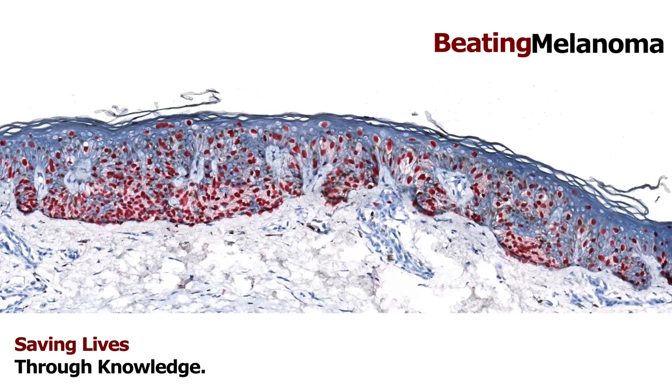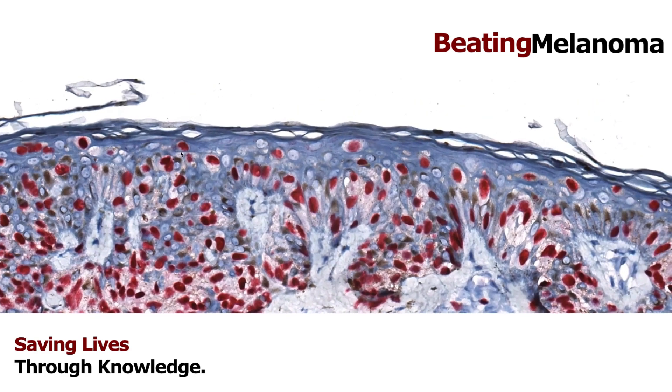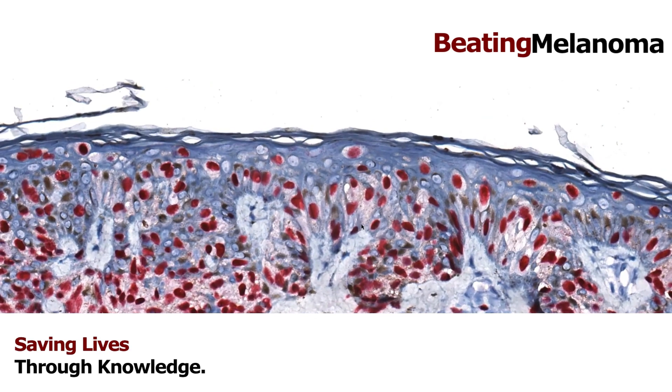Melanocytes normally live along the bottom layer and we don't like to see them moving up toward the top layer of skin — but that's exactly what they're doing here. All the red dots you see are the nuclei of melanocytes: they're along the bottom, yes, but there are tons of them trickling all the way up to the very top layers of the skin. This is what we call pagetoid spread or pagetoid scatter, and it's a pattern of growth in melanocytes that generally is not good — it's one of the clues toward malignancy.